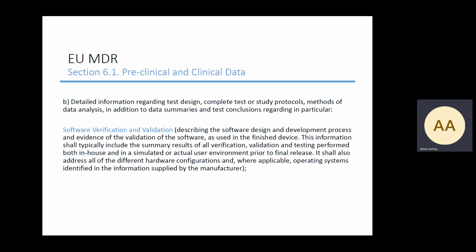So making sure that all of these areas are looked at, even the operating system as well. If you change from one operating system to another, that might be something you have to look at as a change release or change request, which is why it's sensible to try and identify as many operating systems as possible at the outset.